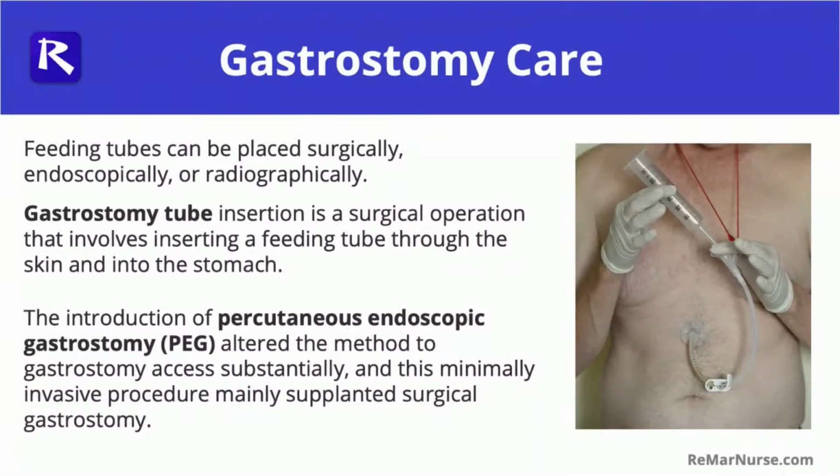I remember when I was in clinicals, I would always hear, oh, the patient has a PEG tube. And I understood what the function of the PEG tube was, but I didn't know how it got there. If somebody asked me how it got there, I would say, it just was placed through the stomach. But no, the PEG has a purpose. I'm so glad that we are reviewing this very necessary and clinical subject.